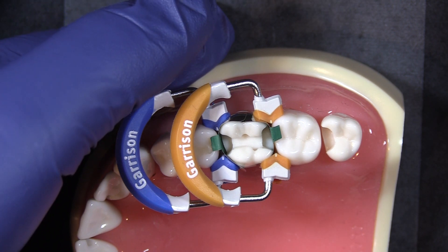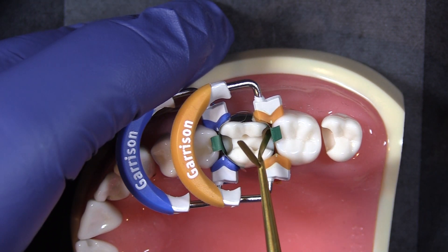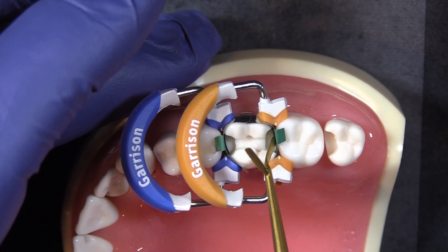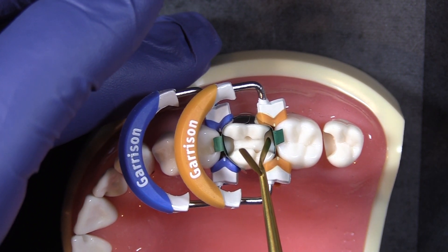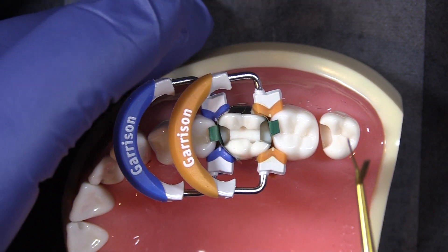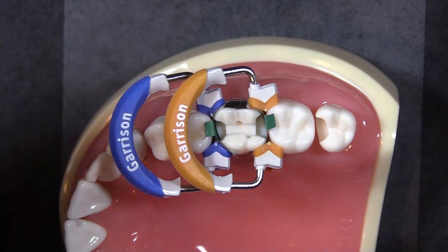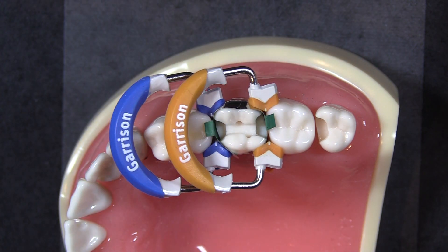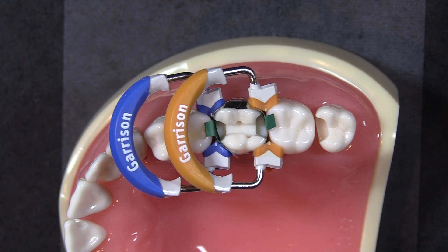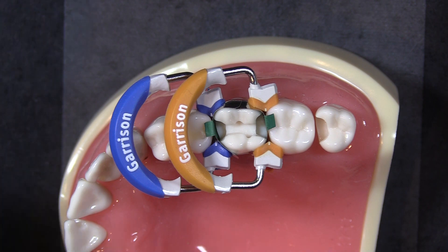I can use a smaller wedge. All I want to do is seal the gingival floor of the box and hold that band up against the tooth to prevent any leakage. I don't have to cram a great big wedge in there, and therefore my contact point can be in a more natural position, with a lot less tendency to create a food trap.